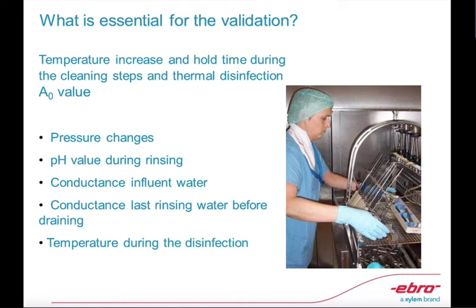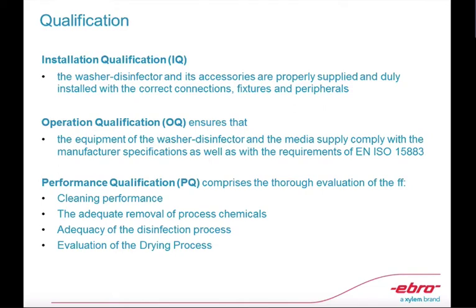I will not be discussing more about IQ, OQ, PQ, but just to inform you that IQ, OQ, PQ explains, verifies, and validates that all functionalities and all process steps in your flow and in your instruments are according to their own predetermined specifications. So this will remain as our guide for as long as the CSSD process flow is not changed or altered.